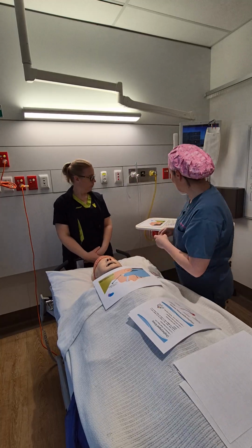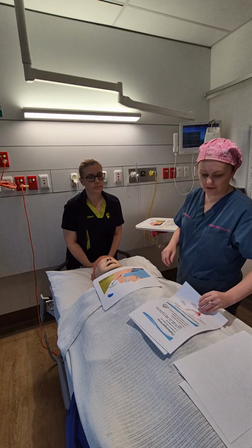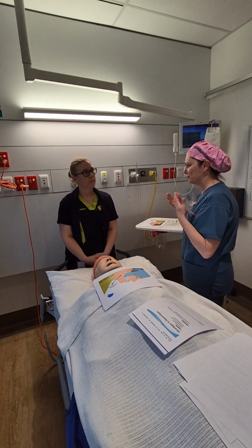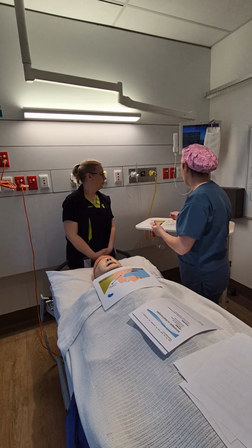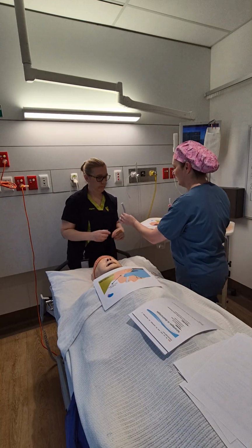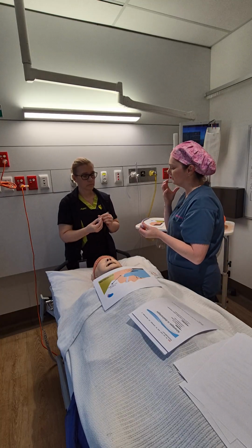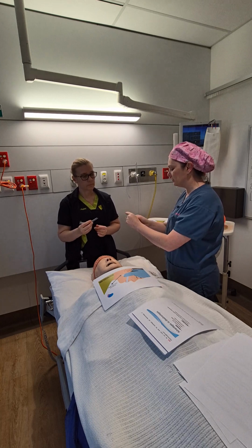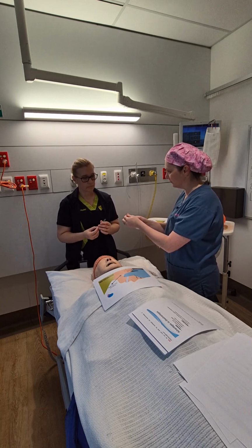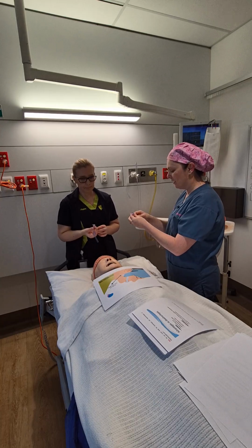Let's move on to the nasopharyngeals. So the main difference between the nasopharyngeal and the oropharyngeal, one goes in the mouth, one goes in the nose, but essentially they do the same thing. But you can see also, this one's a bit softer, just because your nasal palate is much softer than the palate of your mouth, so it's more of a bendy tube. It also has a beveled edge on the end, which makes it much easier for insertion. It has the flange on the top as well.